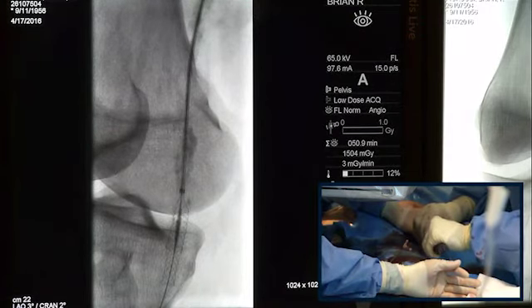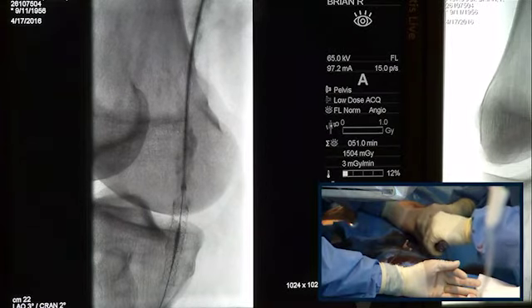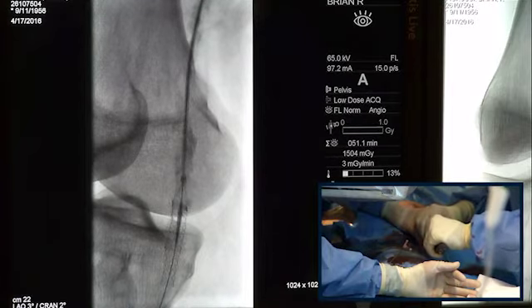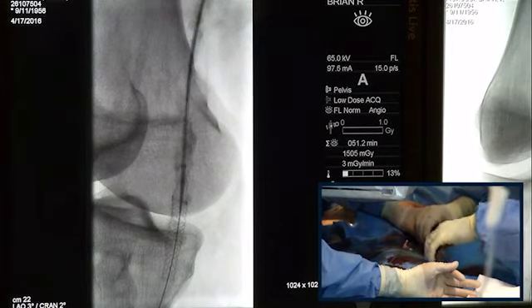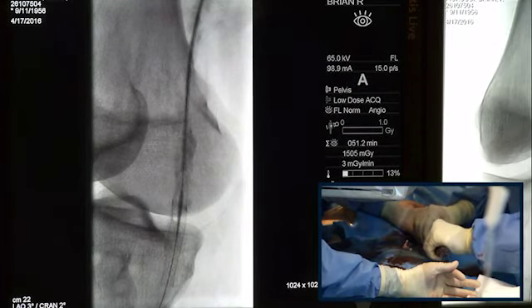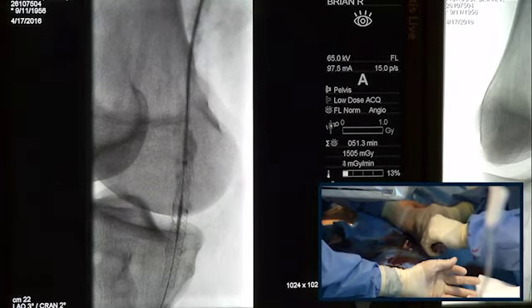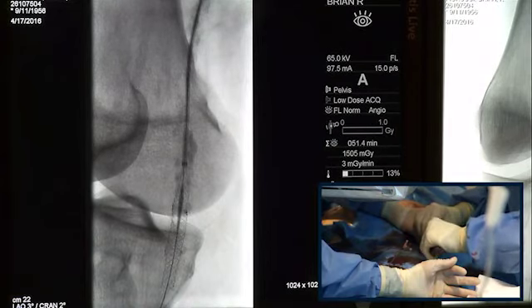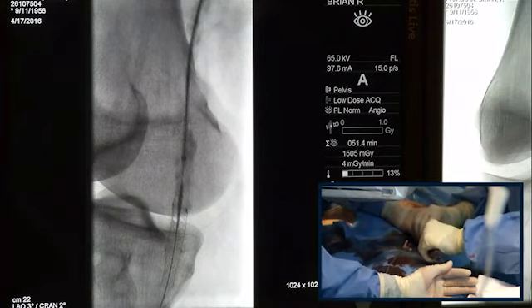So practical tips for the audience when you do this, if you've not put these in before: put a dummy stent in a sterile bag on the side, and that way you see the nominal length and the architecture, and then you try to match that architecture. Very important. Also, if you have dummy stents of the same length, put them out and try to match the length. If part of the stent comes out compressed and part is elongated, typically it resets itself. But as I said, if the whole thing comes out elongated, it's problematic.